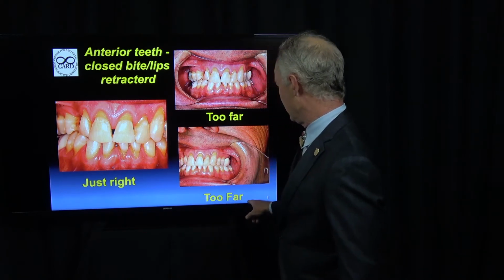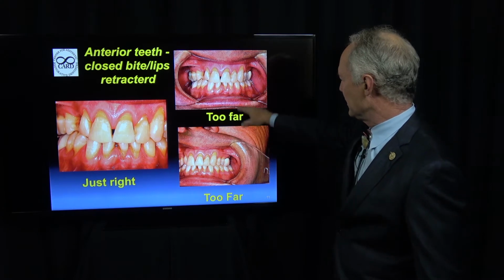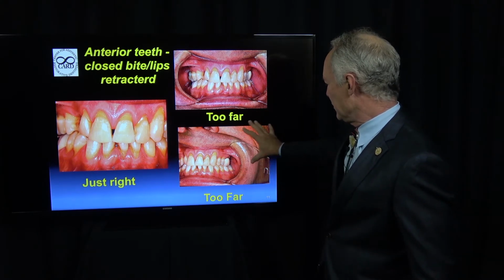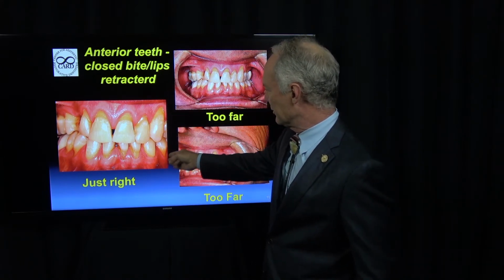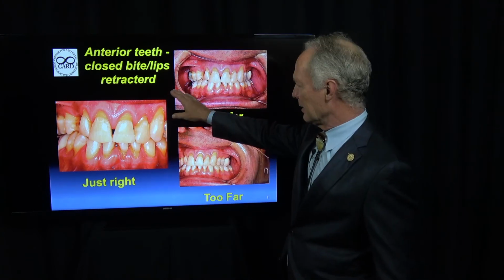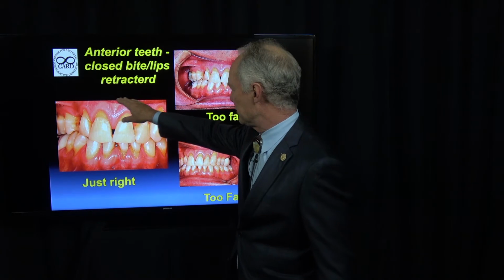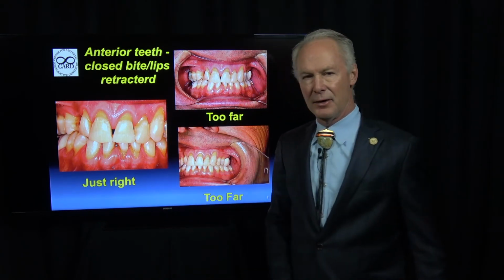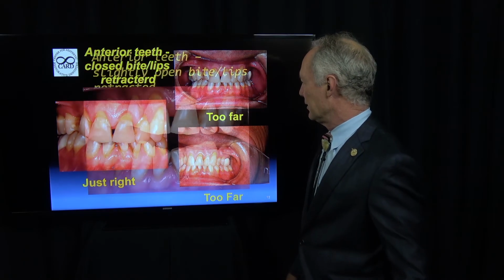This is too far away. So you're seeing the nose. Both of these are too far. Too much peripheral stuff. This is just right, back to about the bicuspids on each side. Not a lot of lips, no nose, chin. Take a lot of the gingival tissue away, just enough to show the attached gingiva and the non-keratinized gingiva.